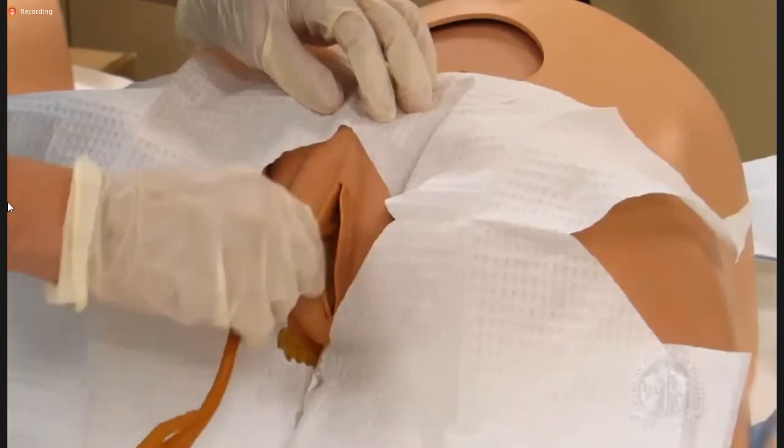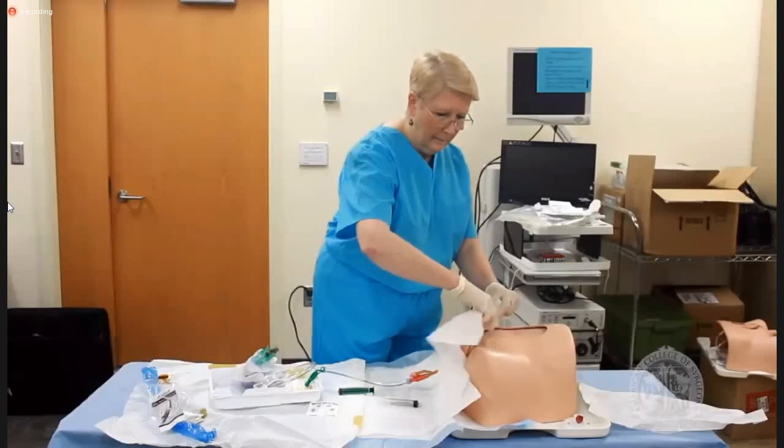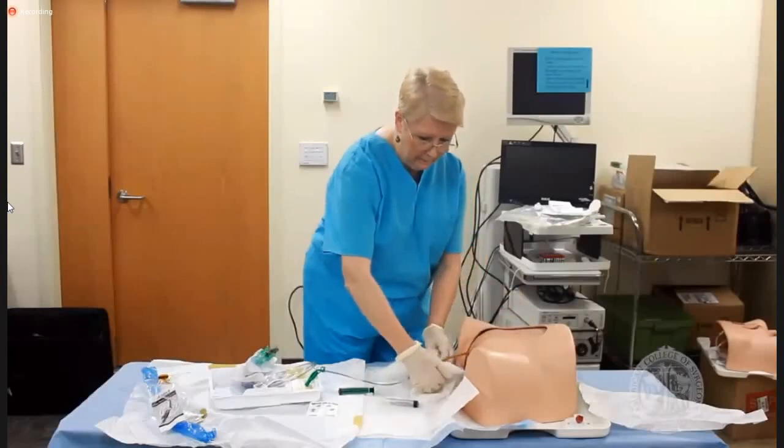Re-advance the catheter 2 to 3 centimeters so the balloon is not putting pressure on the bladder neck. Remove the drape from the patient. Now it's time to secure the catheter.